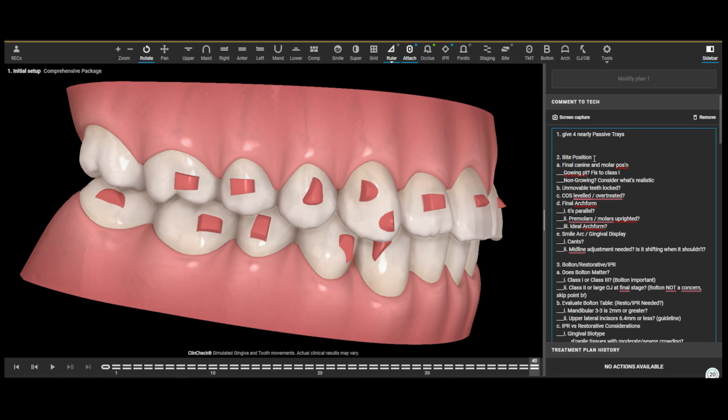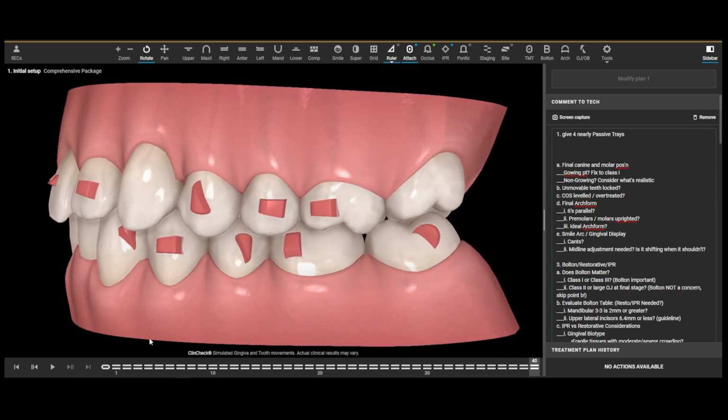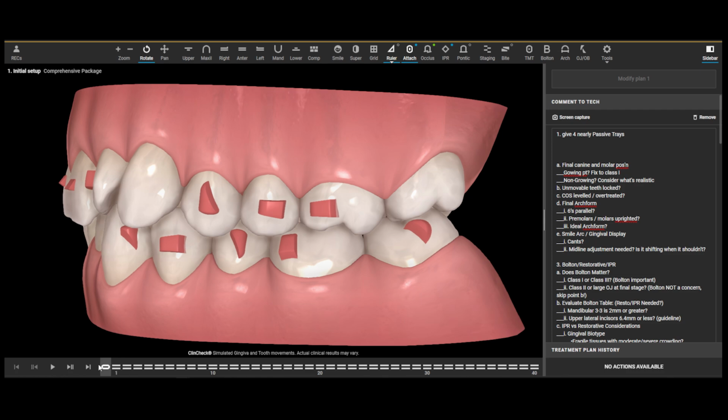Okay, next is going to be the bite position. Are we happy right now with the position of the teeth at the end of treatment? So the first question I'm asking, is this a growing patient? No, it's not a growing patient. If it's a growing patient, you always have to fix to class 1. But in this case, not a growing patient.